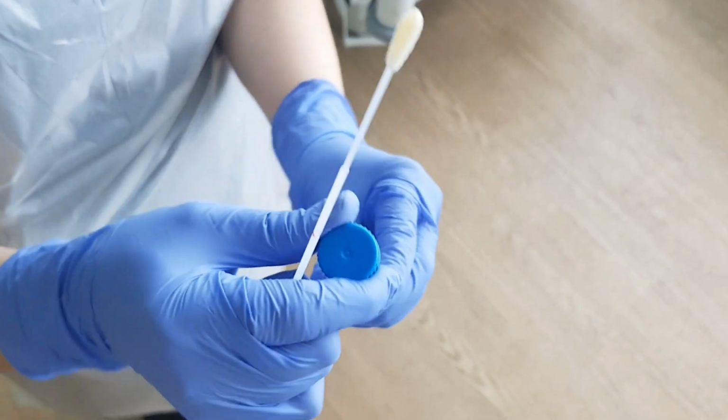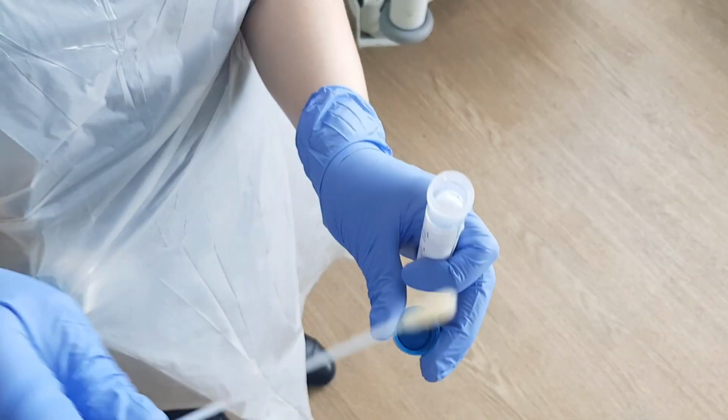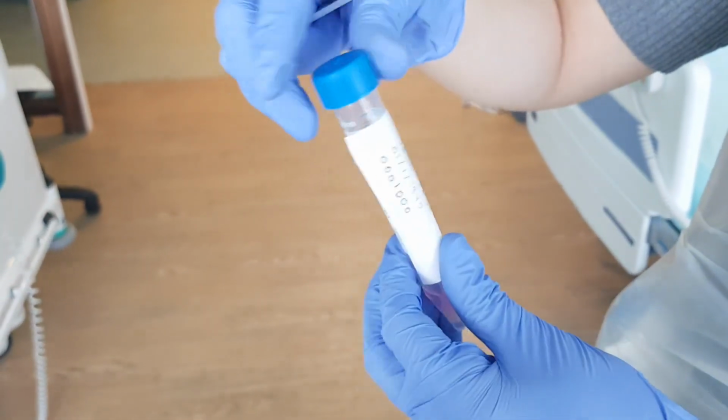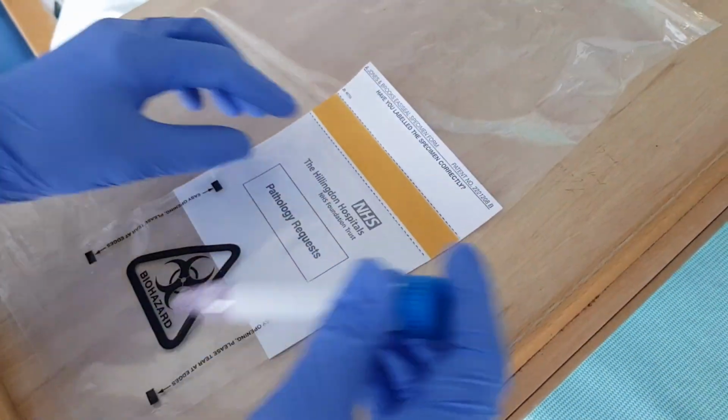And then swab each nostril using the same swab, applying just a bit of pressure. Once that's done, open the sample container and put the swab in it, snap the swab, and close the container. The container has a liquid for sample analysis. Do not get rid of this medium and make sure that the collection tube is closed tightly and properly.